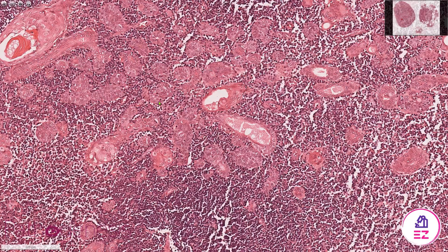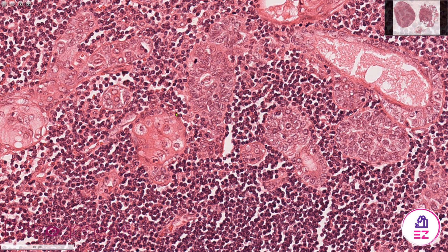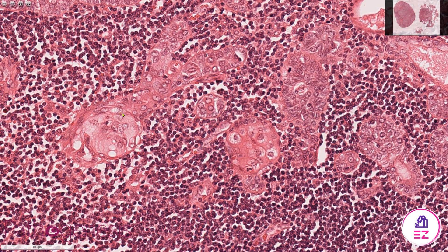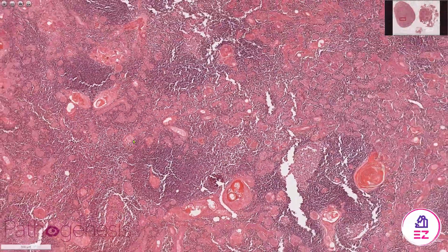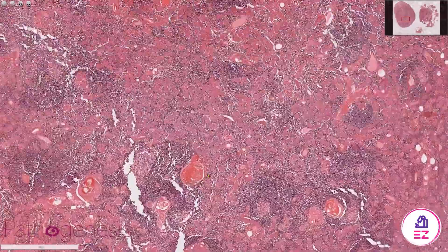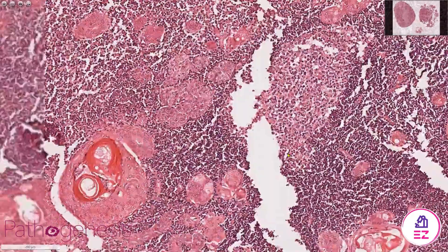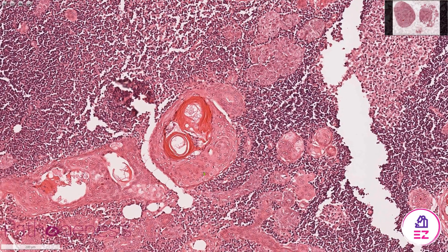Within this lymphoid tissue, when we look more closely, we can see that there are some larger cells with pale cytoplasm, and they represent the sebaceous element of this diagnosis. So, a sebaceous lymphadenoma — it's not uncommon to see keratin pearls and keratin production within this tumor.